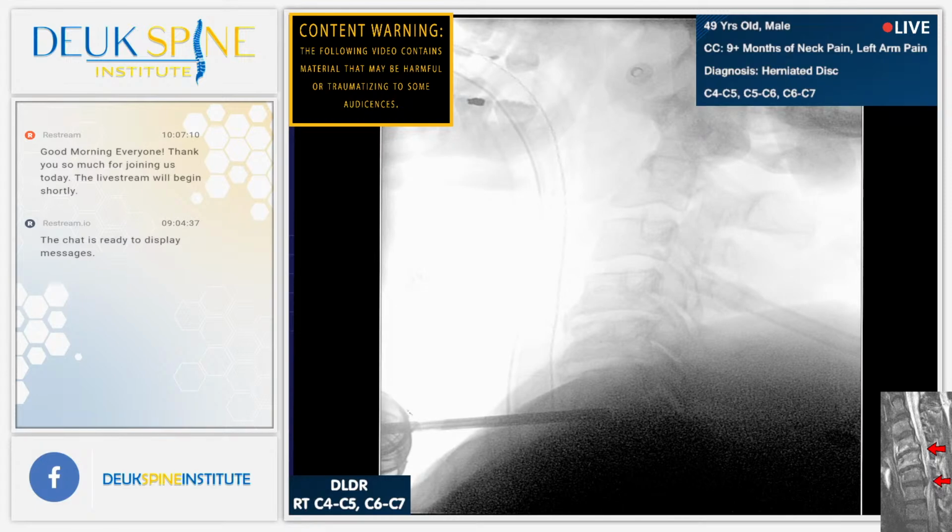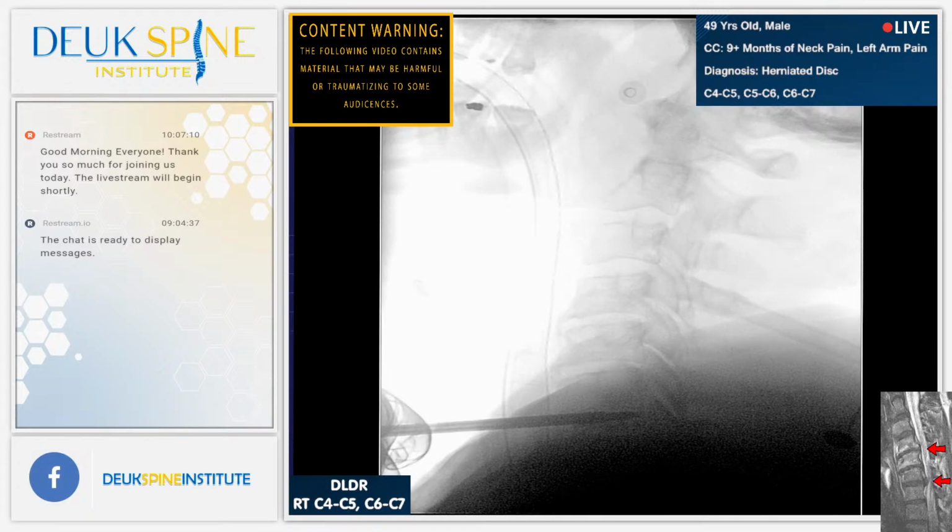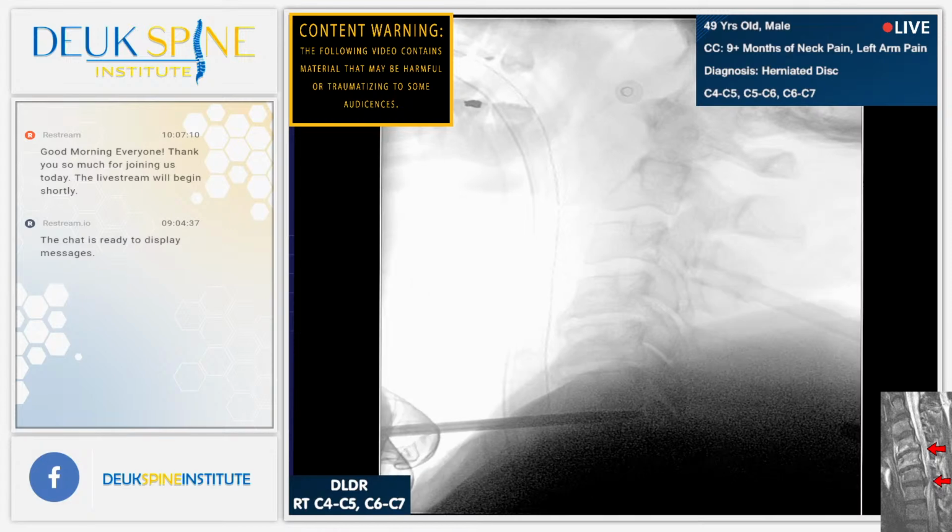This dilator just keeps coming out because of pressure. I could feel it. Can you see it, Henry? Watch, it just pops out. You see that? Yes, we can. It literally, watch this, guys. Take a look at the tip of the dilator. It's literally going to pop out. Can you see it on the camera? Eye in the sky?